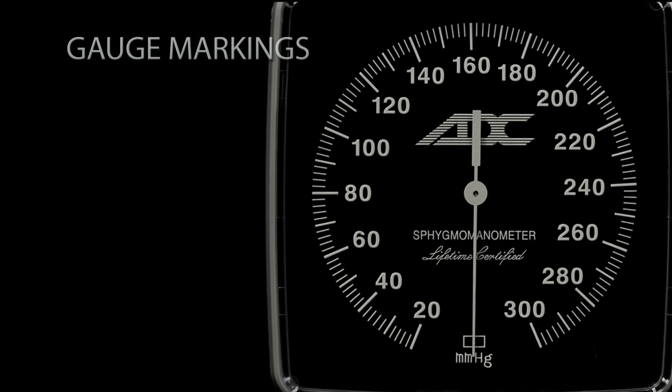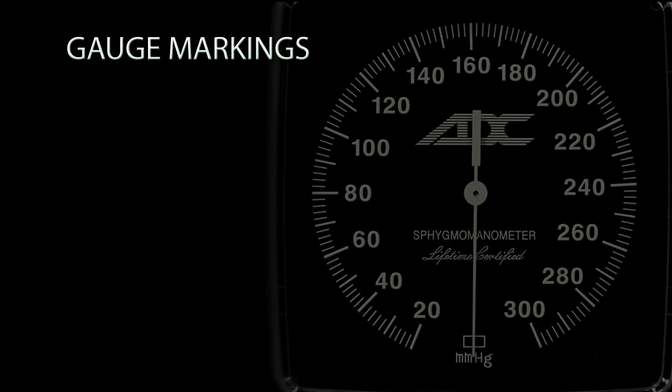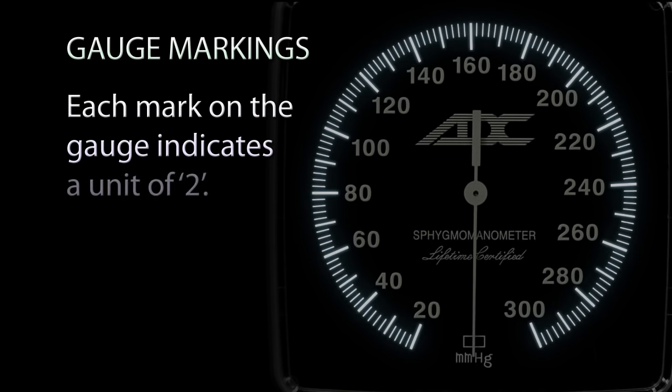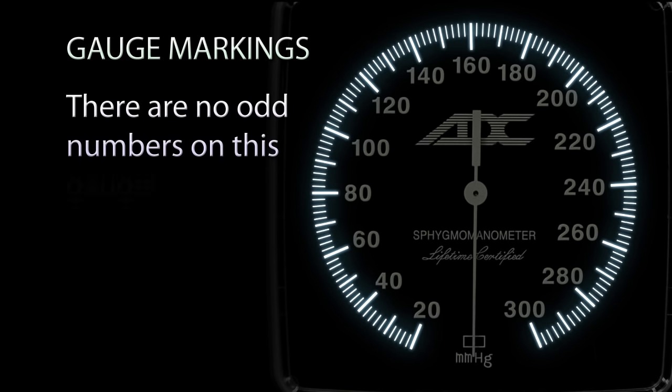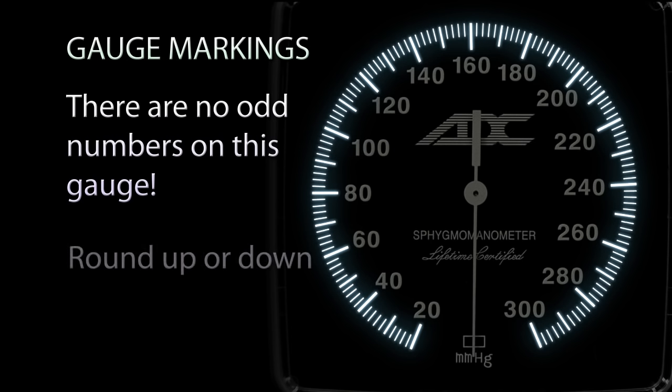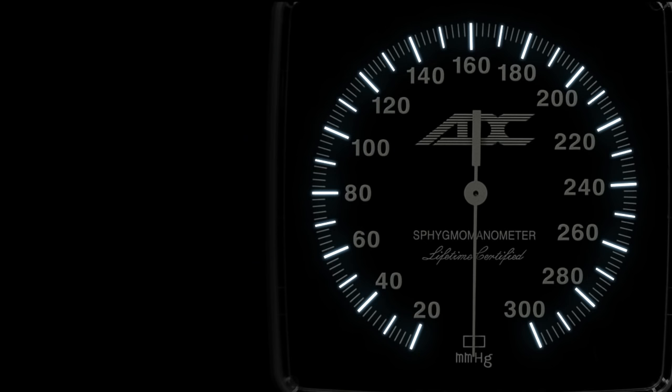On a sphygmomanometer gauge, each mark or line stands for a unit of 2. There are no odd numbers on this gauge. No matter what you measure, you can only read what the units allow. Round up or down, but don't make up numbers that are not on the scale. These longer marks indicate units of 10.